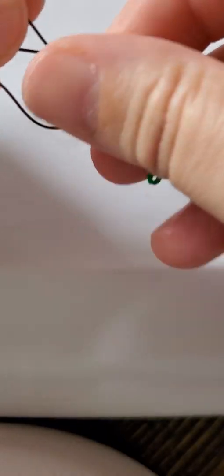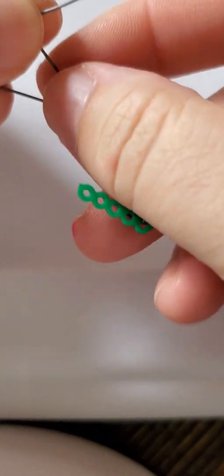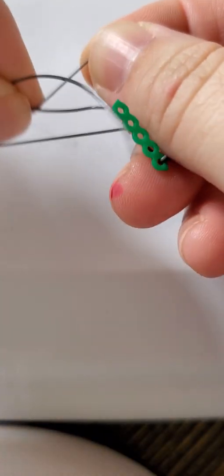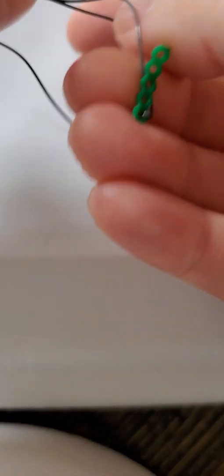I mean, it's just a regular square knot basically is what you're doing. You know, go back to your Girl Scout, Boy Scout handbook and do a square knot, boating, whatever you like to do.